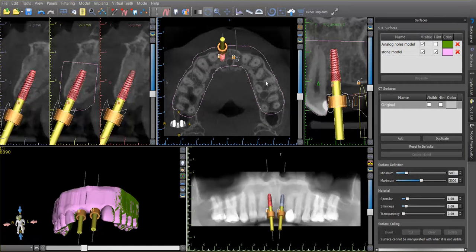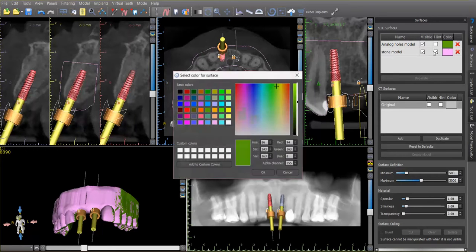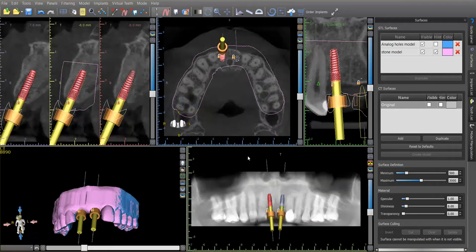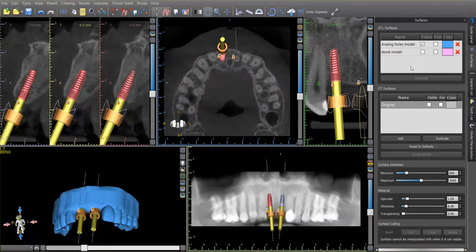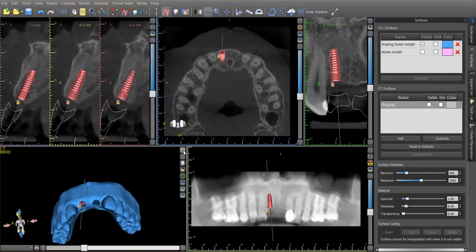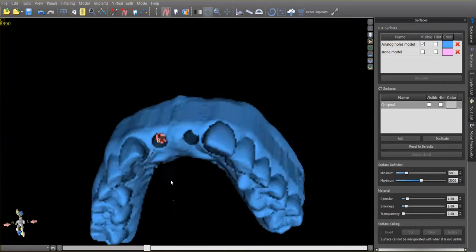What you'll see happen is that we get a second STL model up here at the top, which is colored in green. We'll change that to blue — a little bit easier to see. Now we have a second model. So if I turn off the one that we were dealing with earlier, and if I turn off the implants now, you can see what we've generated.